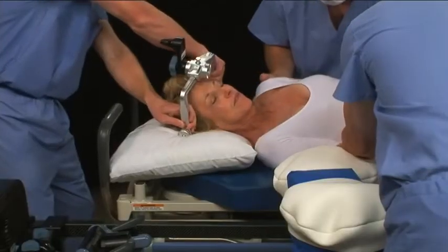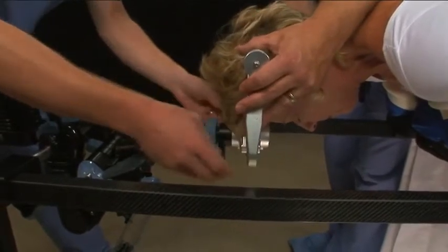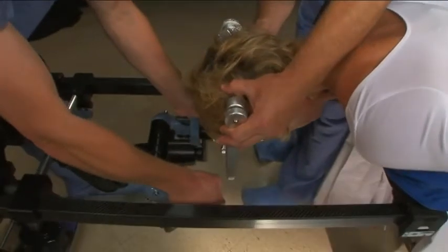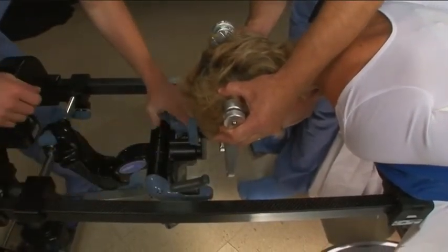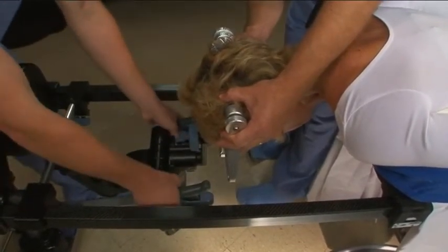Roll the patient onto the frame. Place the patient's head in the desired position. Move the C-Flex toward the skull clamp and drive it into the cone. Tighten the knob on the side of the housing and lightly press on the C-Flex to ensure that it is locked.